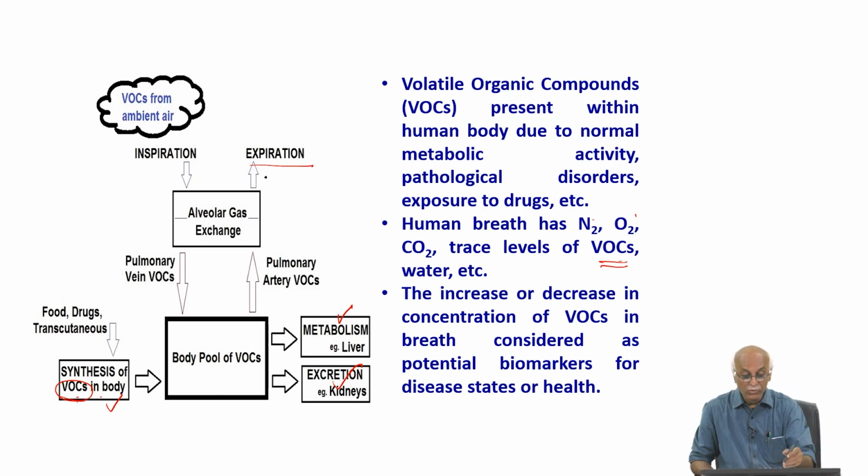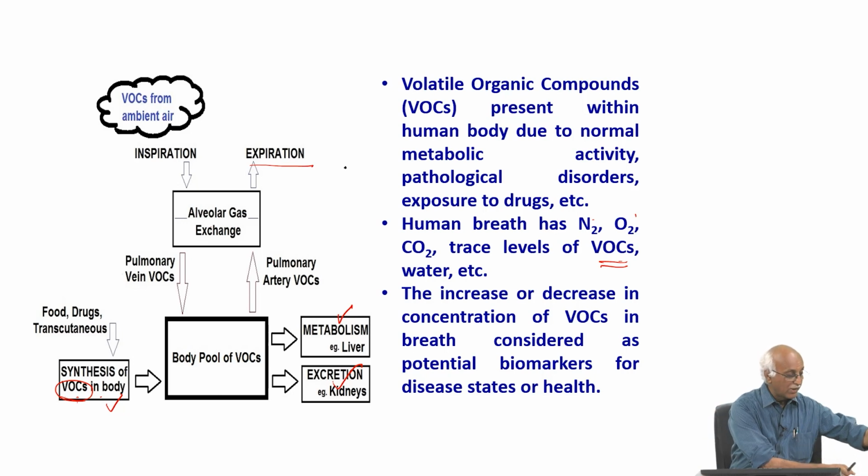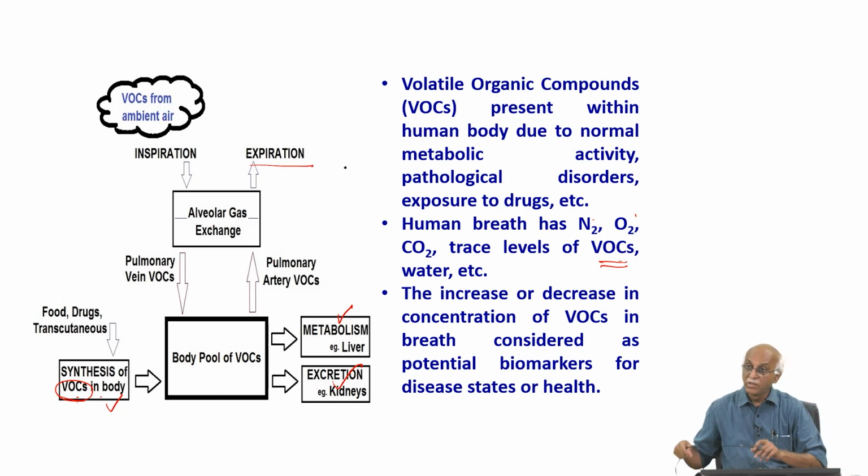So, if we observe some such trace gases in the exhale, they may indicate the anatomical and physiological activities in the blood. Indirectly, if some pathological conditions are there which are affecting this, our exhaled breath may have the presence of such molecules. Now, the presence of these molecules will be of trace amount, very few parts per million.